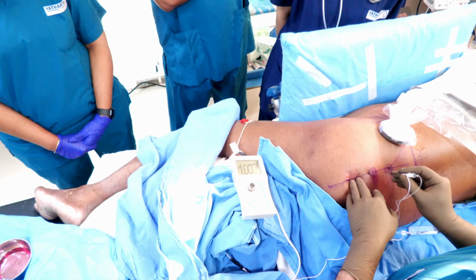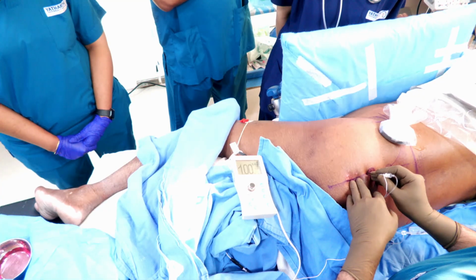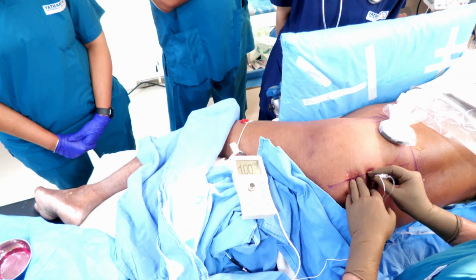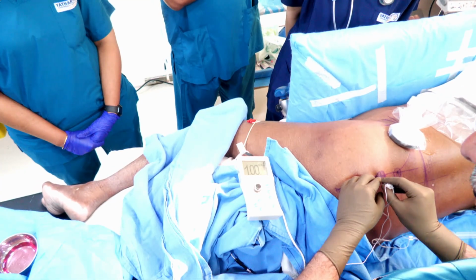So you cannot go too deep either, because beyond the sacral plexus would be the viscera and those neurovascular structures. So you have to be very careful when you needle the sacral plexus.